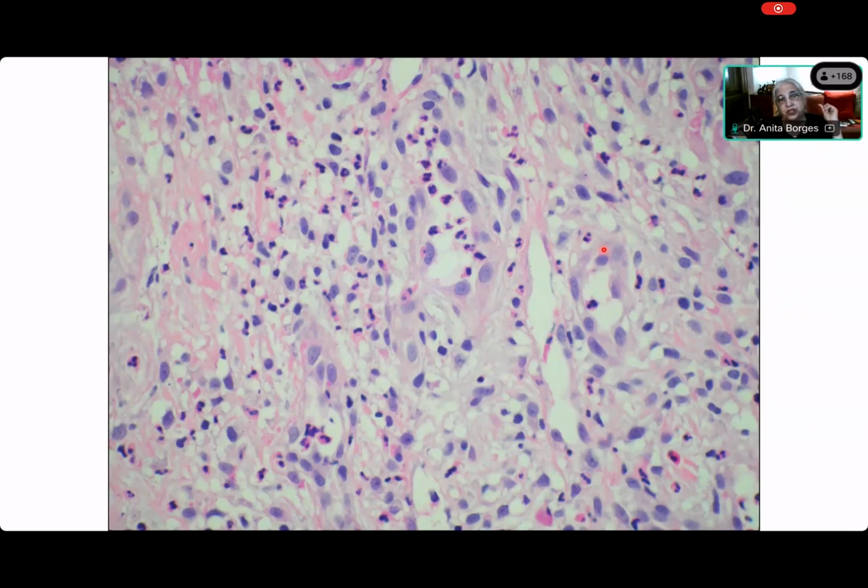Okay. Have you ever seen margination of leukocytes before, Kedar? No. It's there, but you have never noticed it. Okay. None of the students notice that in every inflammatory condition you will see margination of leukocytes, but nobody notices it. That's not the reason I put this up.